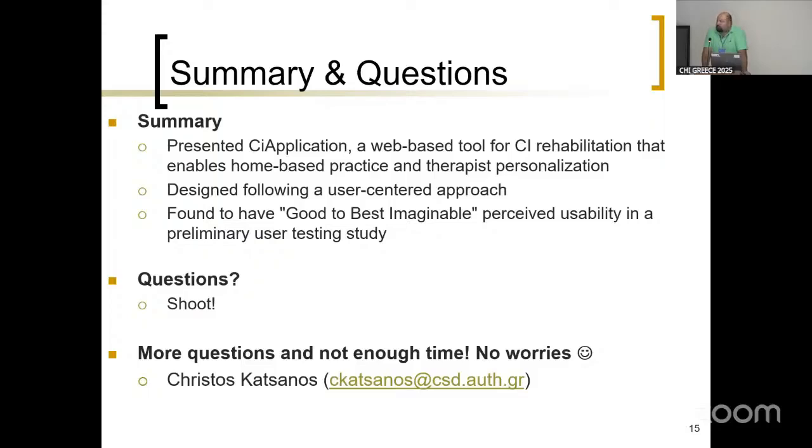So it could be a great extension in the future, but here we had the experts that provided the content. I can understand the limitations, but the idea is that anyways, the therapist creates personalized content. If it's for a 1 year old, 2 year old, he will obviously create animal sounds. If it's for an older person, he will create the appropriate content.